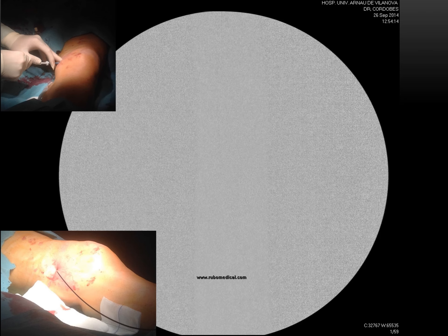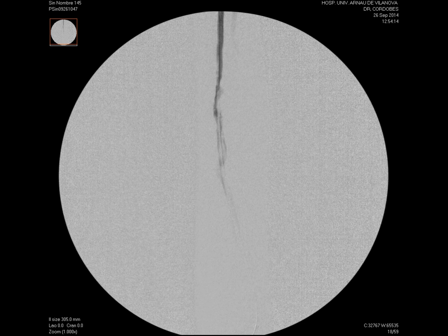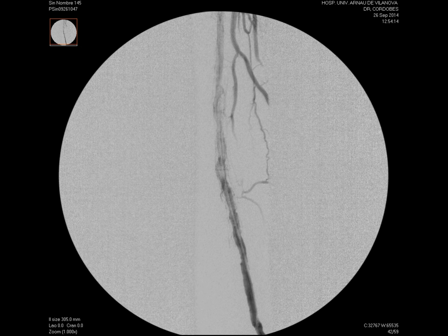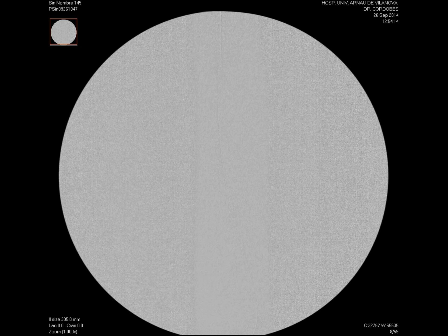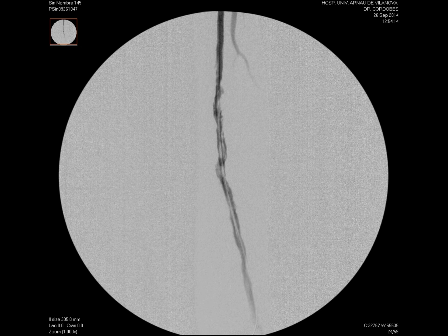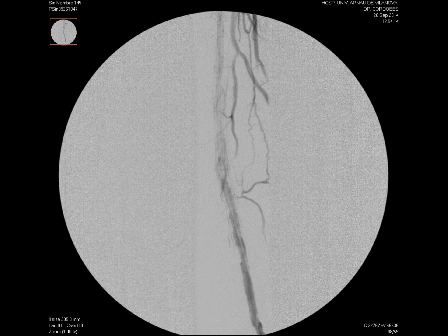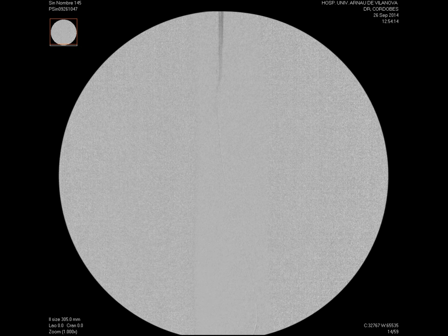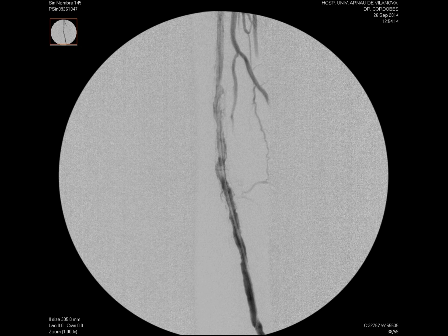We added one more device from the retrograde approach to finish covering the residual dissection. This second device can be released from the antegrade approach, but in this case, being a tall patient, the system did not reach. As a result of this inconvenience, our first Presto technique arose when it had not yet been described — we performed the first Presto technique without knowing it in 2014.